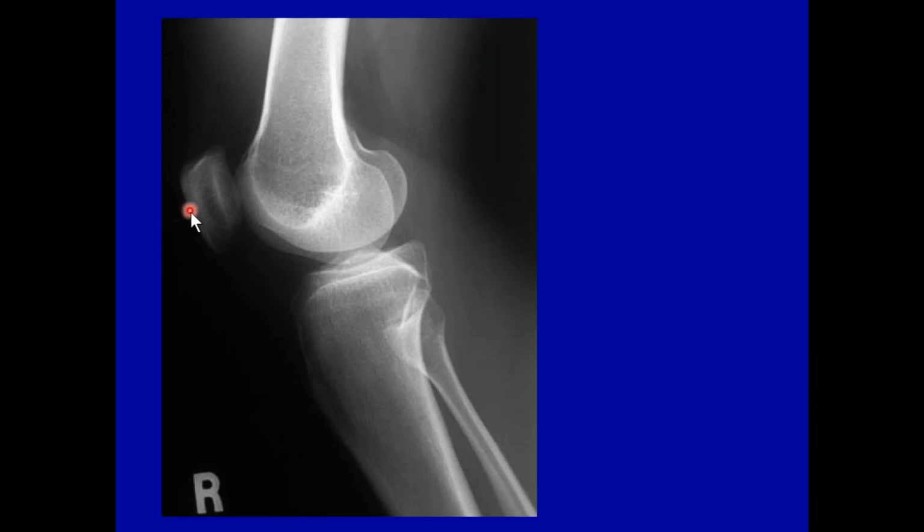But if the patient said it's been hurting there, something called housemaid's bursa, people that garden a lot and are kneeling, they get this, and this prepatellar bursa can fill with fluid. So if there's some indication that the kneecap was involved, that's when you'd be asked to do a skyline view, if the doctor says, and it takes too much to Google it or look in the book, which page. If you need to know that, simply get a hold of us.